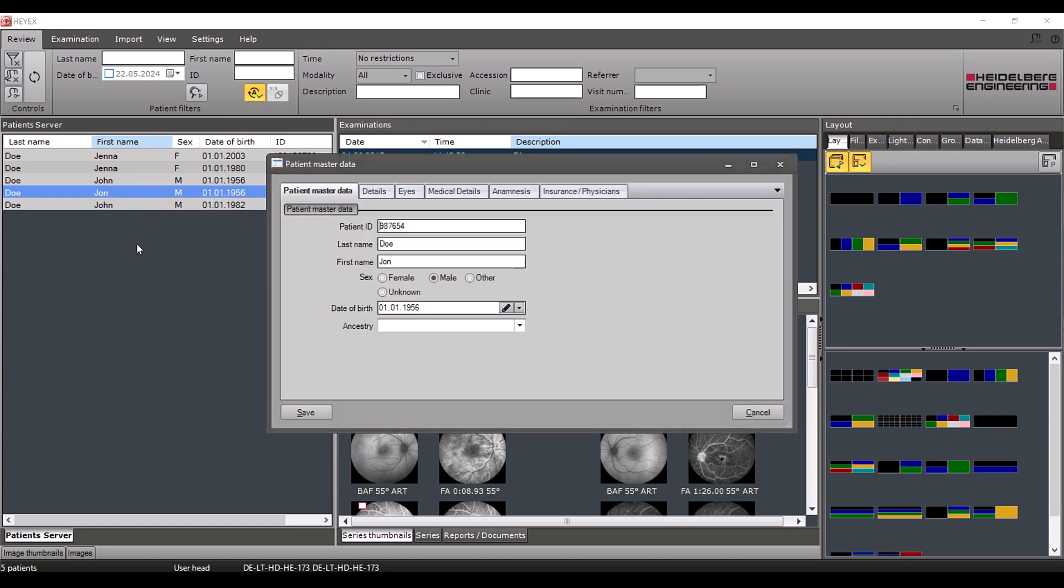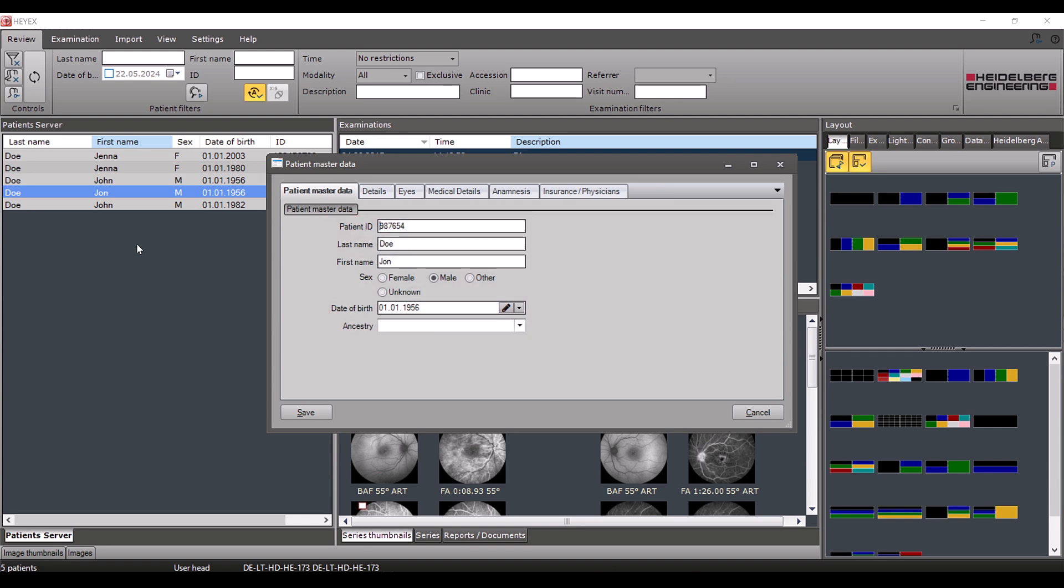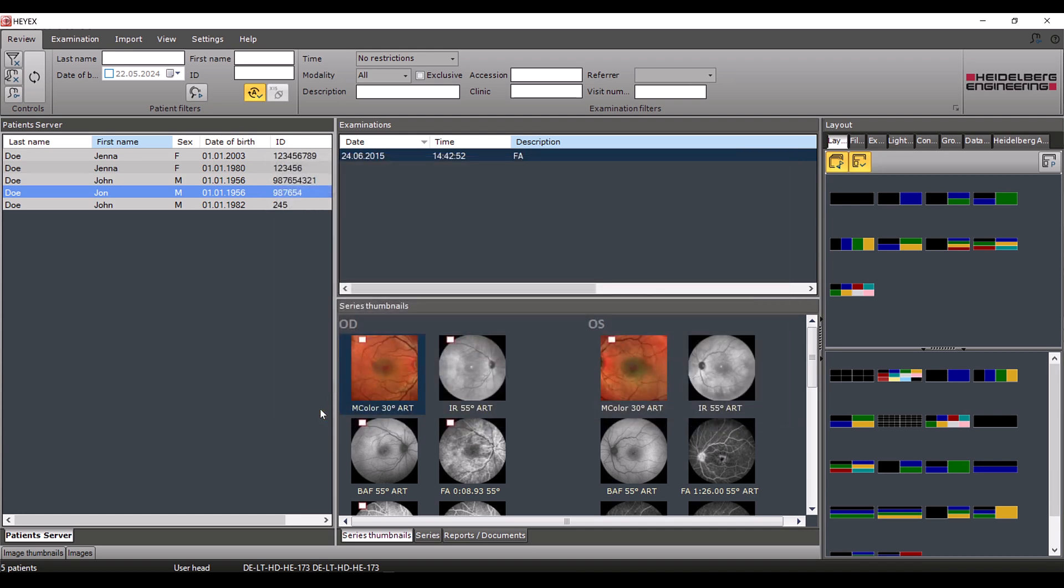The patient master data window opens. This gives you an overview of all of the patient's master data and you can change it if necessary. Once you have made the required adjustments, save the changes by clicking save. You automatically return to the navigator.